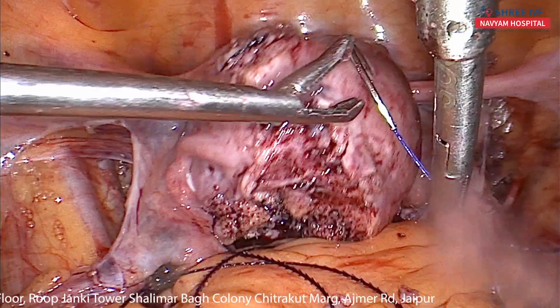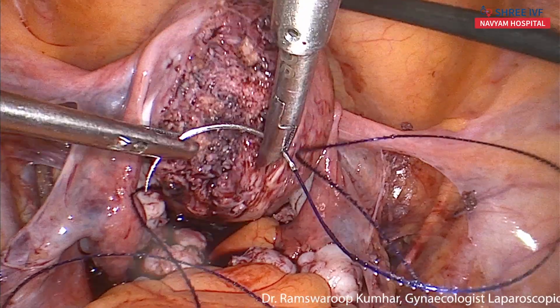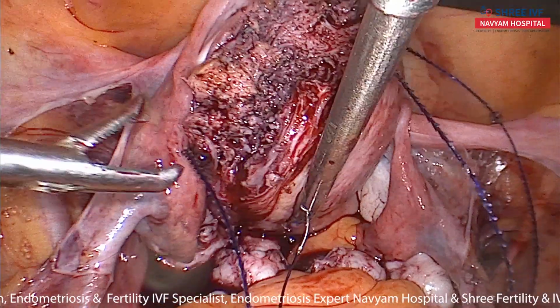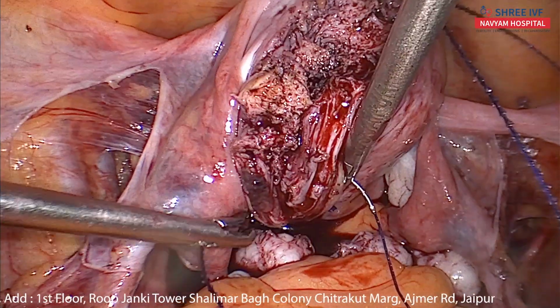Is there any knot? No. This middle port suturing is a little tricky, but very useful. So we should learn it. We should use it wherever we need to suture the posterior wall.